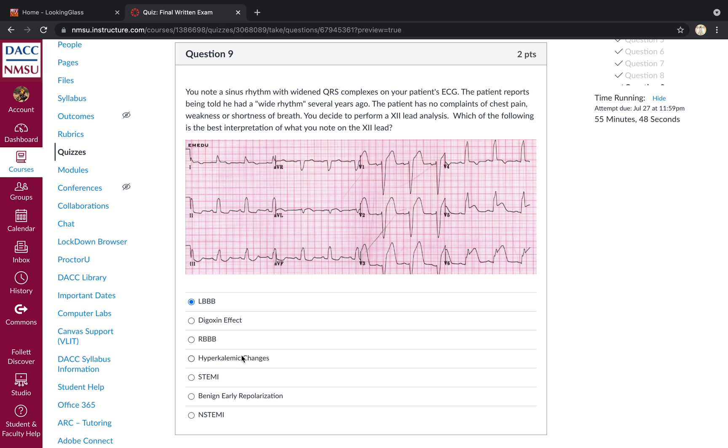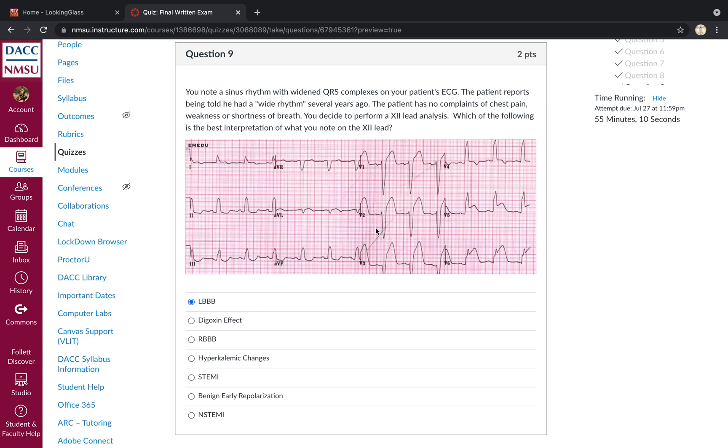And we know that a left bundle branch block tends to cause lots of ST anomalies. Right bundle branch block is not present. Hyperkalemic changes. The T waves are not classically, have not been classically changed or altered in the way we'd anticipate. This is not a STEMI at this point. There are no signs and symptoms of acute coronary syndromes. And this is classic for left bundle branch block with, if you look in your V leads particularly, you have an appropriate discordance, right? So you have ST elevation, which is caused by left bundle branch block. The elevation moves upward and the QRS complex moves downward. That is appropriate discordance. And so that strongly suggests a bundle branch block over a legitimate ST elevation. Benign early repolarization is not present. And this is definitely not an NSTEMI.